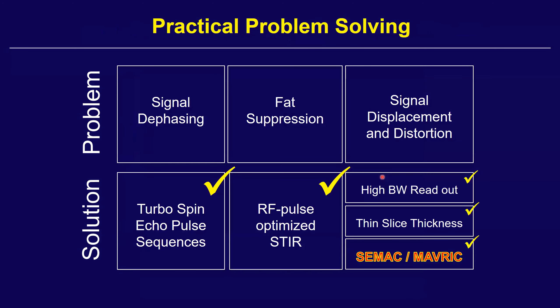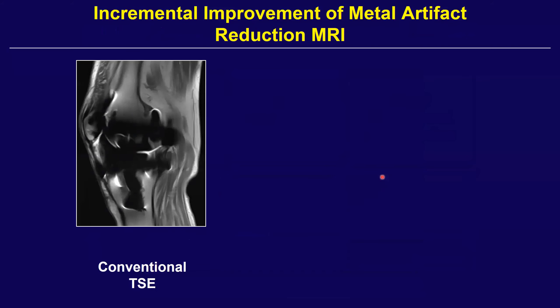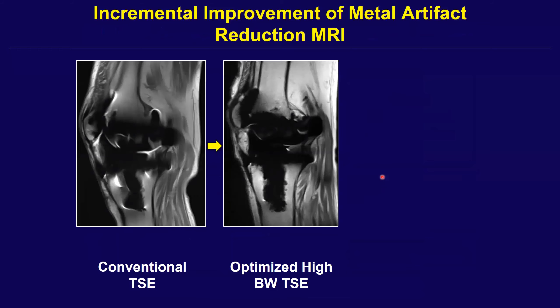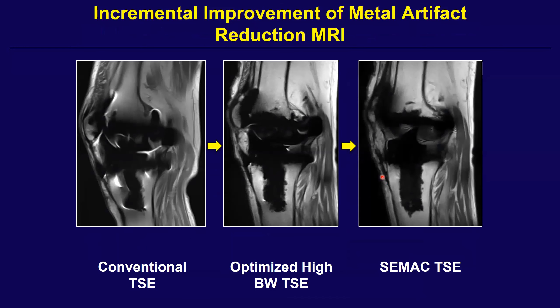Applying advanced metal suppression reduces through-plane signal displacement in the slice encoding direction — the dimension otherwise missed with high bandwidth alone. Following the evolution: from conventional TSE, to optimized high bandwidth TSE, to adding SEMAC algorithms on top — which also uses VAT — all of a sudden you can see the joint space, pseudo-capsule, fluid between components, tibial component, and part of the tibial tray. You can also see the bone-implant interface to better advantage.